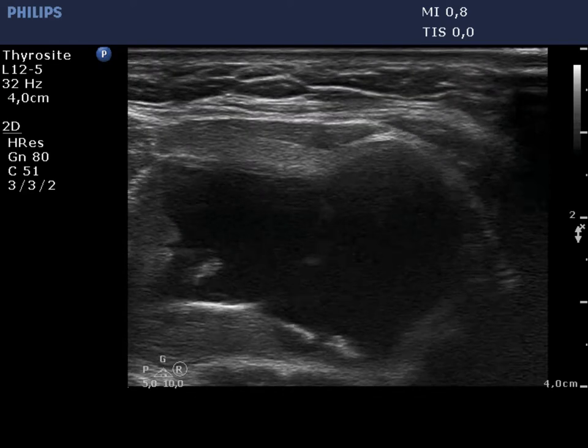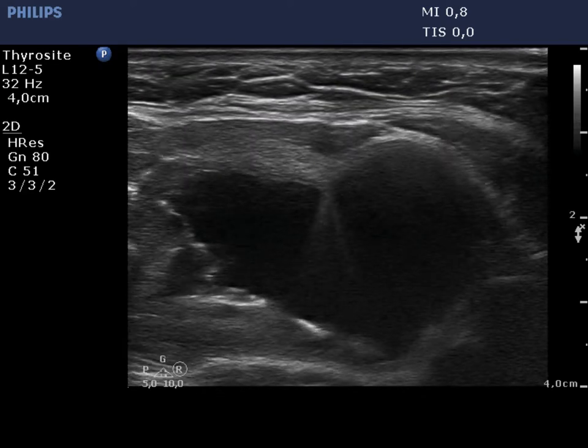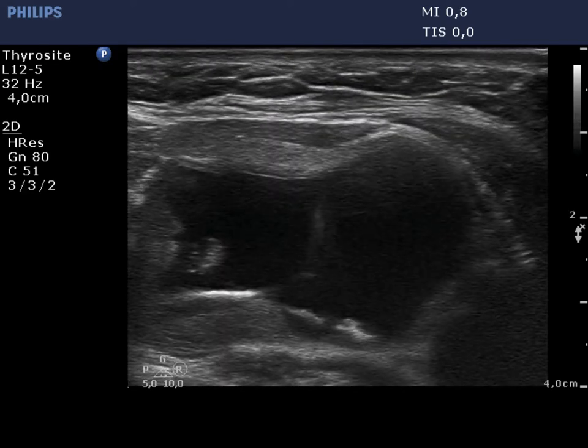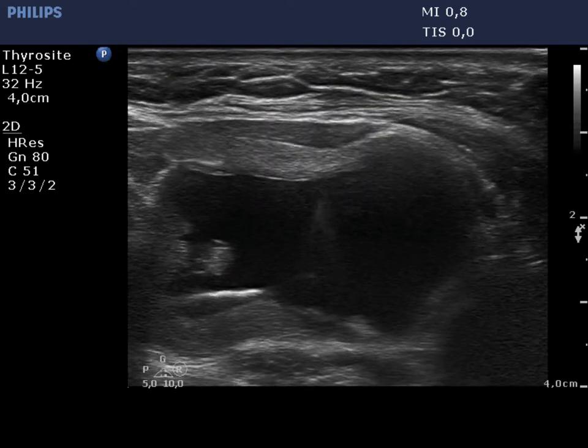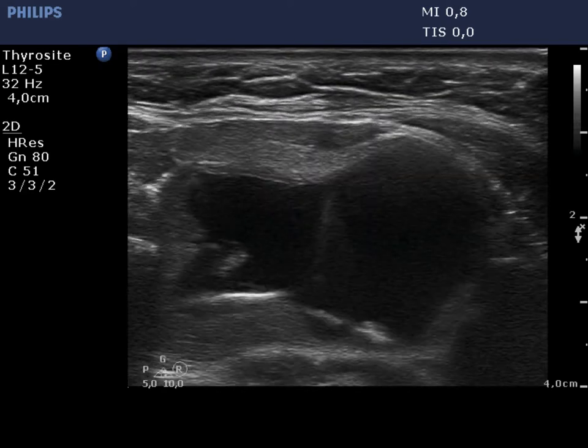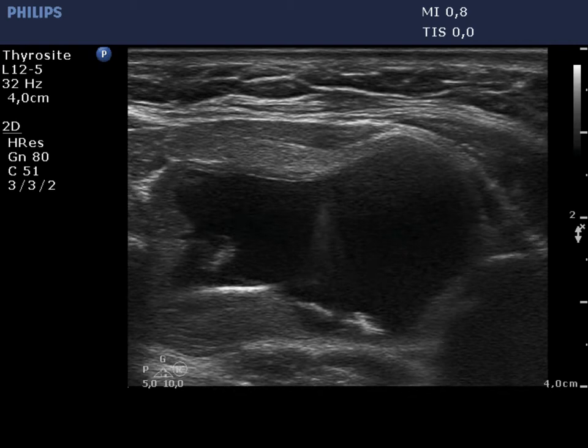Now, we present the first part of ultrasound-guided removal of 22 ml yellow cystic fluid.